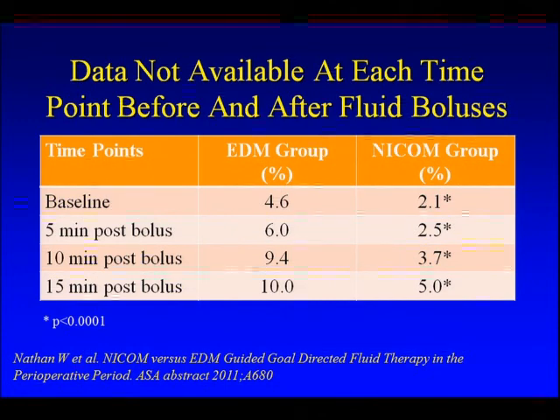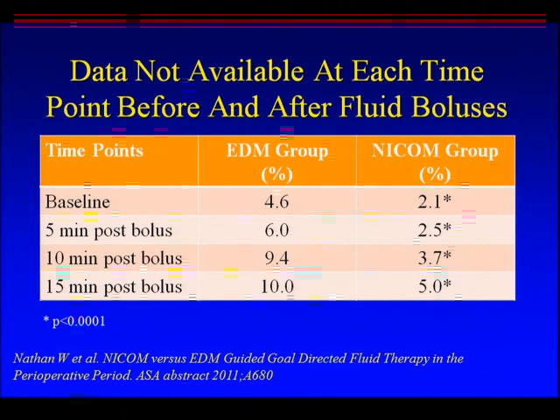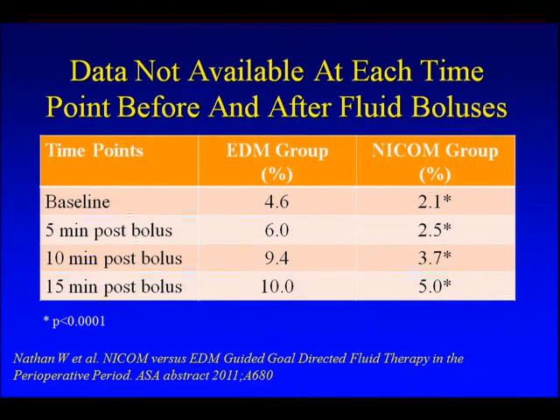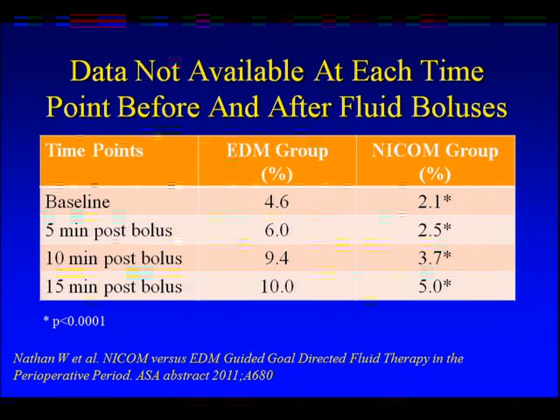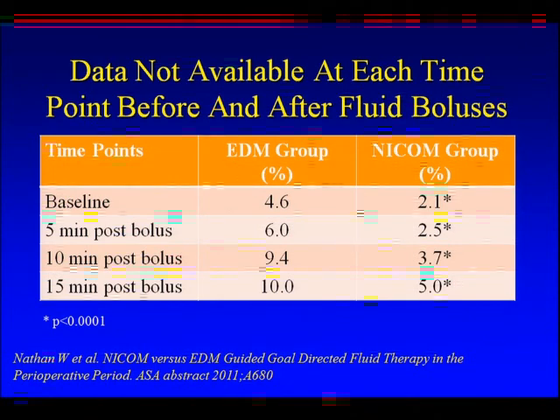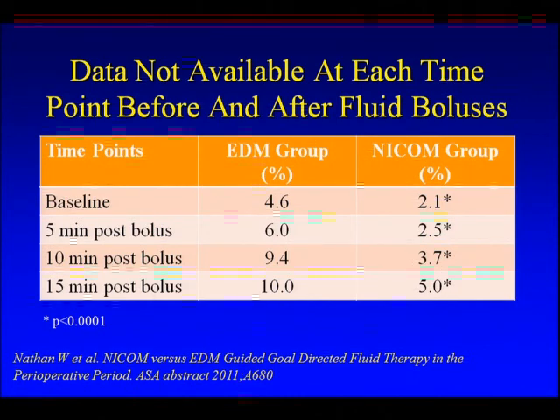And I'm sure that those of you who are in the operating room use a device and give a fluid challenge, and sometimes when the surgeons start the electrical cautery, your esophageal Doppler screen is basically a snowstorm. You can't get a number. And when we compare with NICOM, there were about twice as many times during the bolus of fluid that we were not able to get data with esophageal Doppler compared to NICOM.